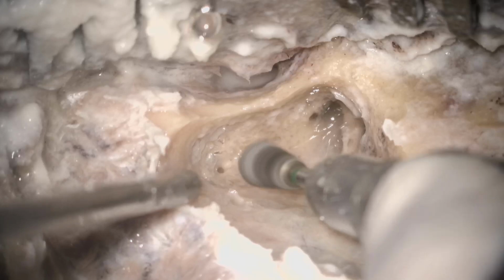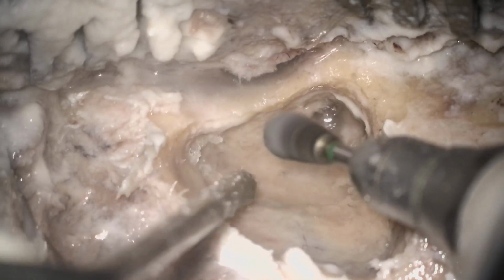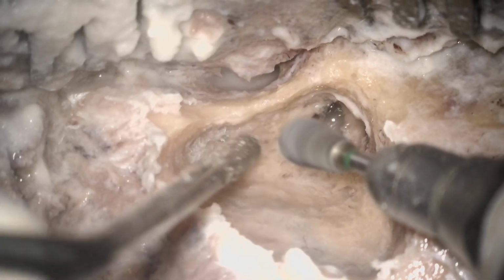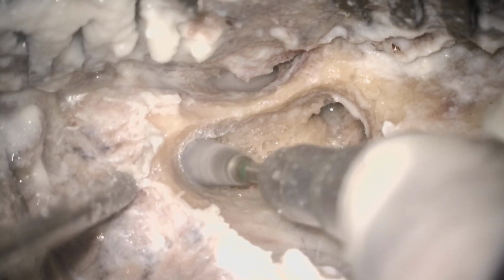Because if the mastoid air cell is infected and there is accumulation of some debris, then it is very important to remove all the cellular system so that you can remove all the accumulated debris and the infected particles from the cellular area. But there is another school of thought also.